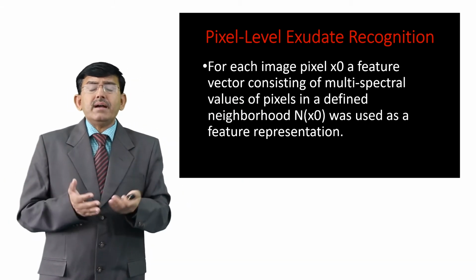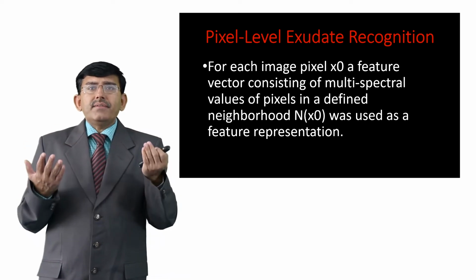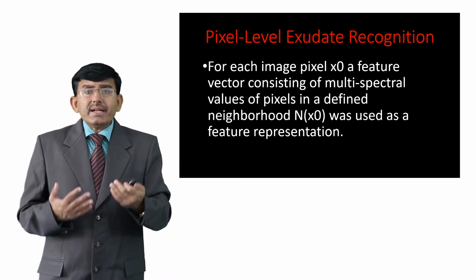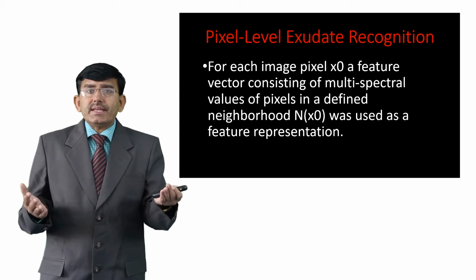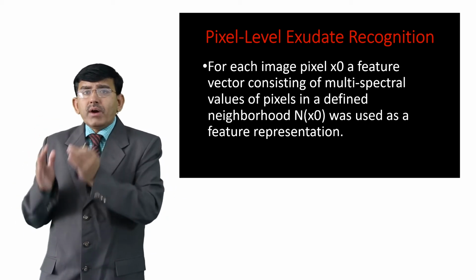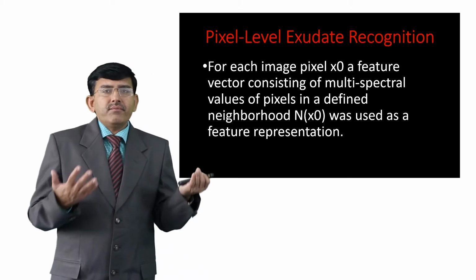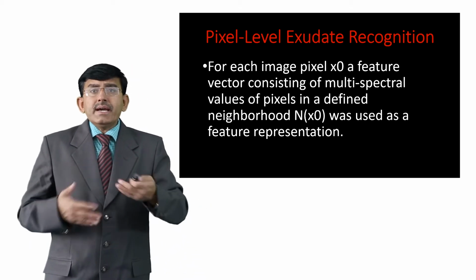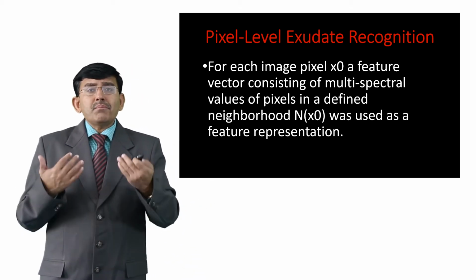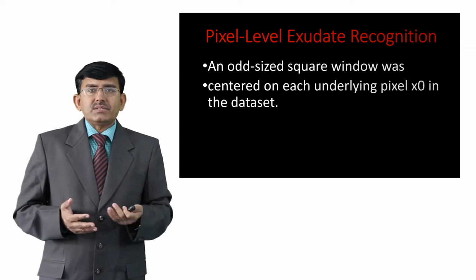Multiple band data are combined together to form an image, and this helps to get the images in such a way that features which are invisible in one band may be visible in another band, and we can get all hidden information from the image with the help of multispectral analysis.